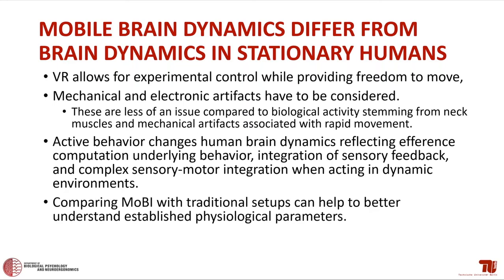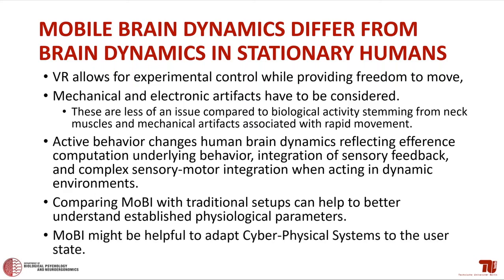It's important to compare MOBI results with traditional setup results — we always contrast a MOBI condition with a stationary condition to understand how well-established parameters like P3 or alpha desynchronization replicate and how they change. Time-domain parameters may change significantly in morphology, while frequency-domain parameters might be more stable — but we may discover new aspects. Finally, MOBI itself using EEG or fNIRS can adaptively improve VR and cyber-physical systems by embedding users more effectively and changing VR environments to match specific user states.